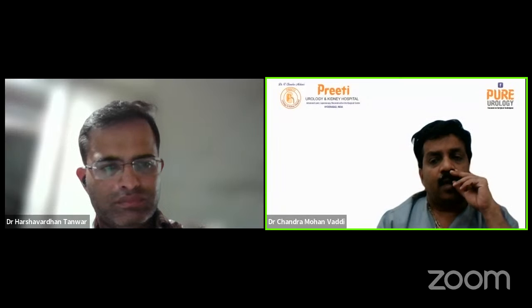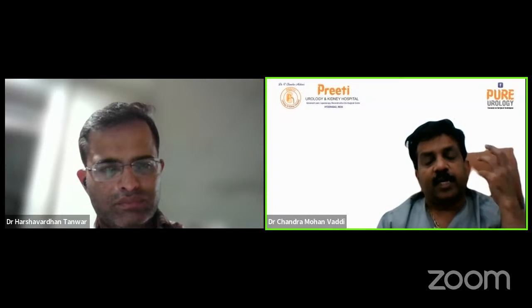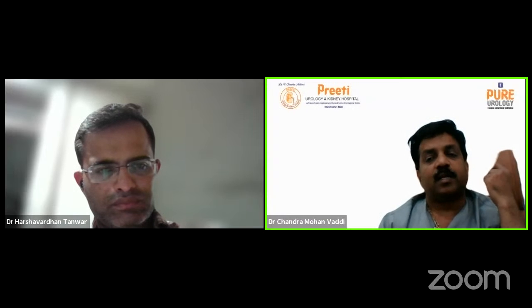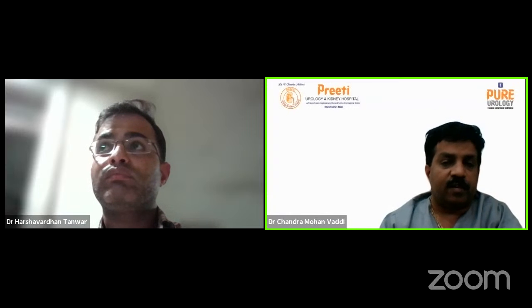Definitely it is a skill. Scientifically, in future, you will get all the questions which I asked again and again. He has to defend that. But technically, it is a good understanding of the anatomy, RGP, filling of the contrast, air pyelogram, contrast density assessment. He has mentioned everything very well.